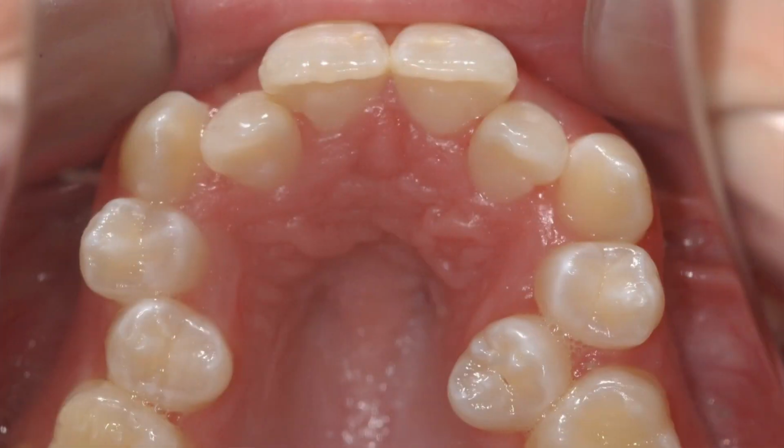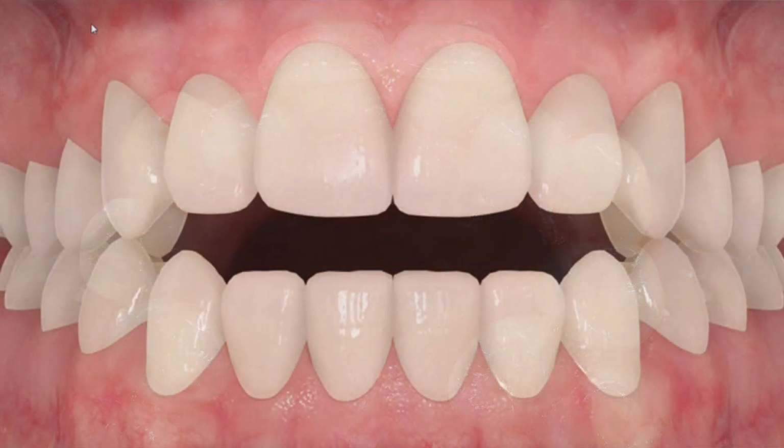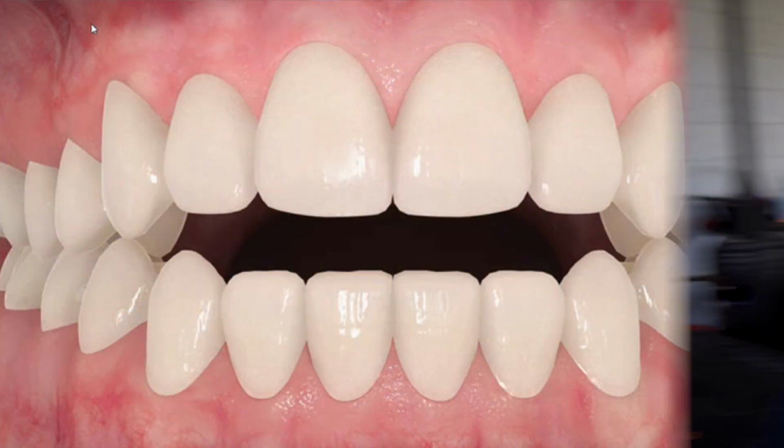As of the recording of this video, Smile Direct Club does not offer buttons, and they mention that their service is only meant to correct mild to moderate teeth corrections. This makes sense because it would be really hard to move teeth in a big way if you don't have these buttons available to you. Meaning that if you have severe crowding or rotated teeth or an open bite or major issues going on, then the orthodontist is probably going to be the best way to go.